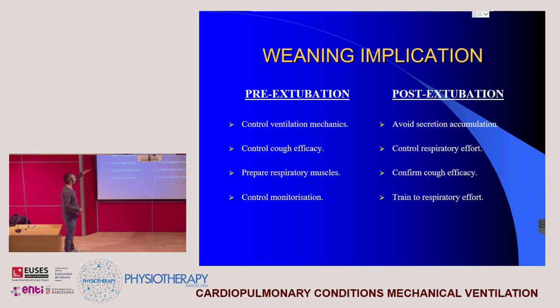First of all, in the pre-extubation, we have to know that the mechanical ventilation mechanics are going well. We have to control them. Also very important, we have to evaluate and objectify the efficacy of the cough.